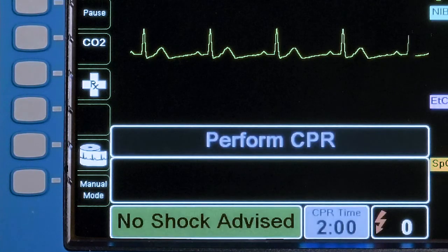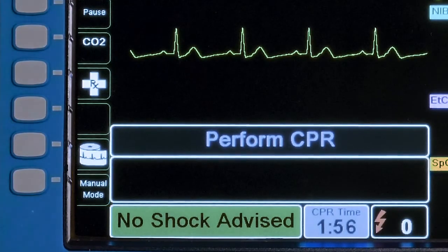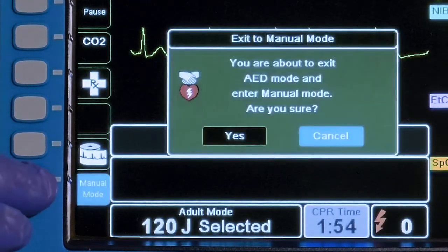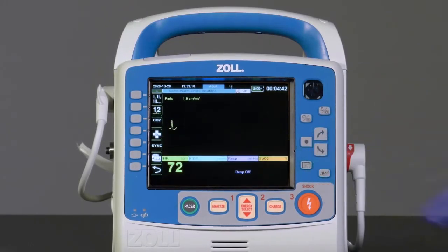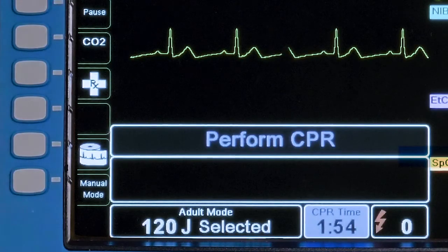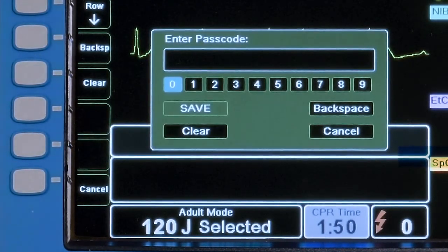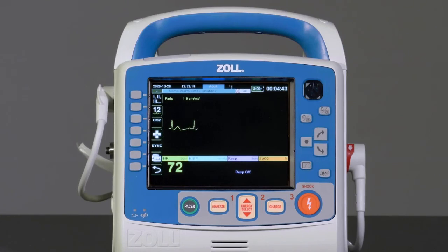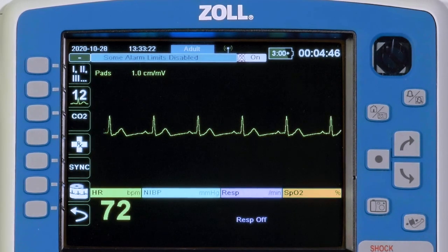To enter Manual Mode, select the Manual Mode key on the left side of the screen. Depending upon configuration, either confirm the change to Manual Mode or enter a 4-digit PIN to confirm the change. Once Manual Mode is entered, full control of the X-Series Advanced — including pacing, synchronized cardioversion, and manual defibrillation — can be obtained.